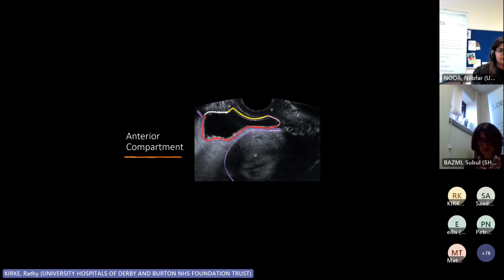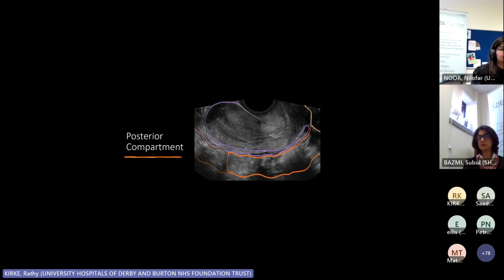Now, you only get that feel if you've done many, many ultrasound scans, and you have to do it on every patient. So you get a feel of what a normal pelvis is like, what a normal pelvis moves like when you do an ultrasound. And then when something is stuck, you get a feel of what being stuck looks like.